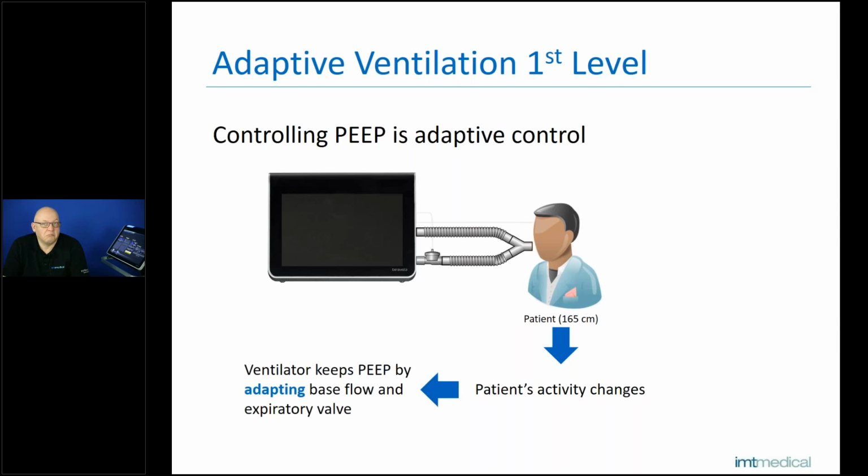This means PEEP is already the first level of an adaptive control. So everyone using ventilators day by day is already in contact with an adaptive kind of setting.